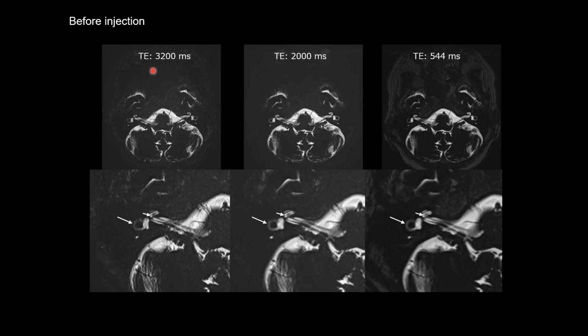So we decided to use a slightly shorter echo time, 3200 milliseconds. With this echo time, we can visualize the lateral semicircular canal continuously. And shorter TE image can be used as an anatomical reference.